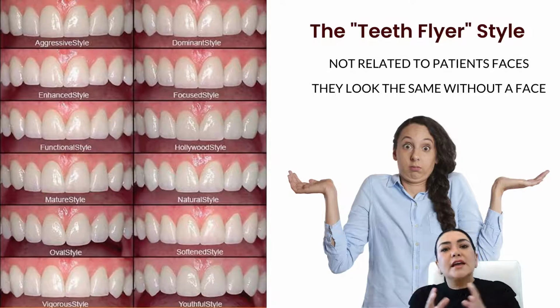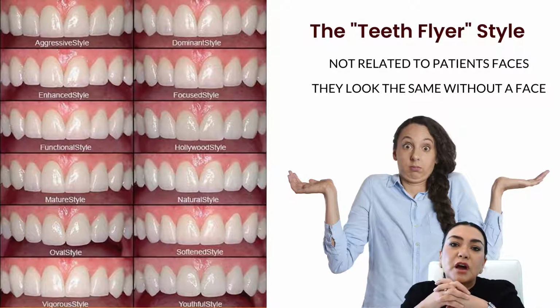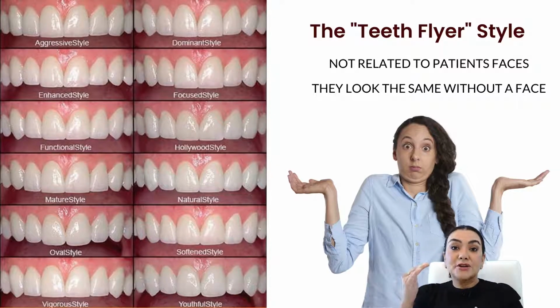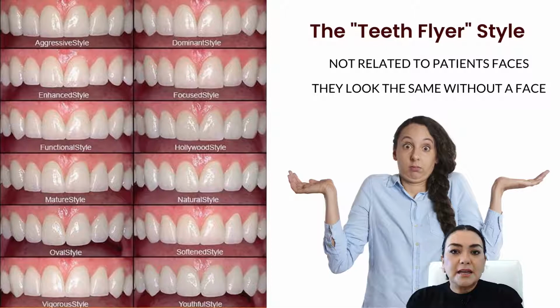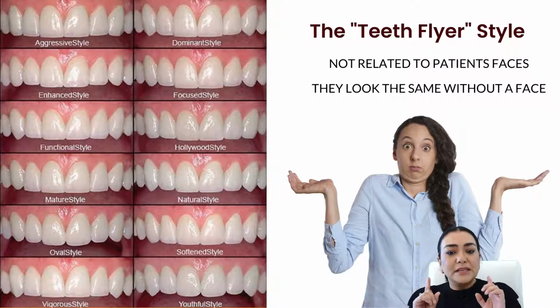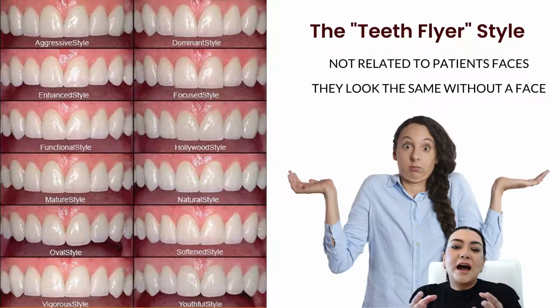Another thing that I noticed in different offices is the paper flyer. Just imagine when you sit your patient in the chair and you give them a flyer to select different smiles, what kind of smile they would like to have. This was very useful in the past, but what kind of impact are you going to cause in your patient if the patient doesn't see themselves there? They don't realize the effect of that smile on their faces.